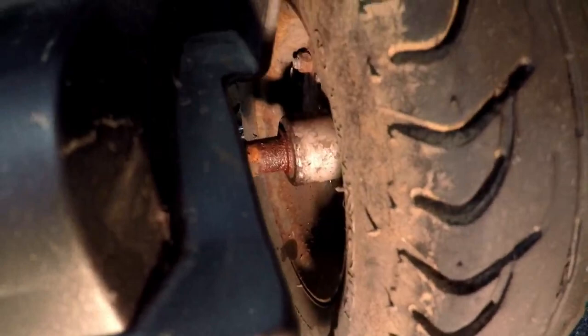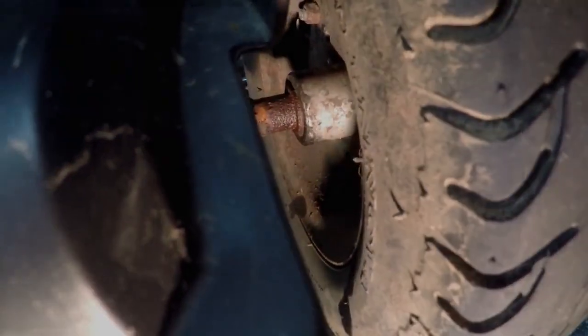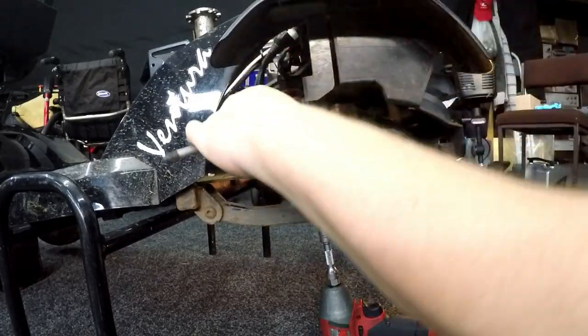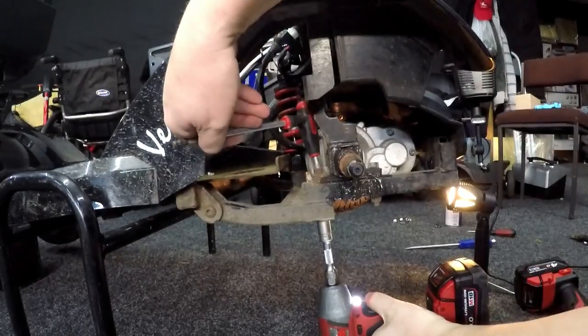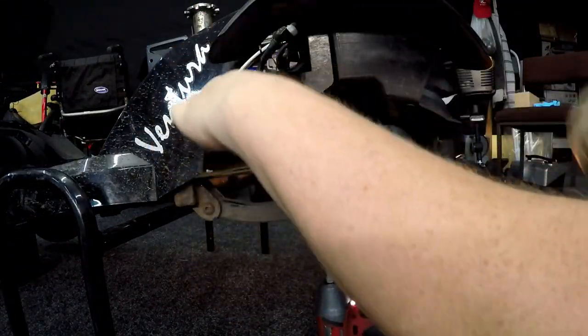The other side is seized solid. It's not moved an inch, a millimetre. This has not moved whatsoever. So I reckon I'm going to be at this for some time. Now that the other side of the transaxle is seized solid, I'm physically going to lift the whole transaxle off together with the other side of the wheel. So what I'm going to do is, I've got my socket on the bottom. I just need to put the appropriate Allen key on the top. It's going to be a difficult one, this.